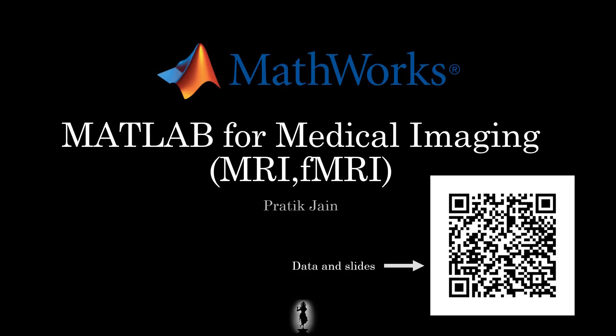Good, so yeah, this is MATLAB for medical imaging, in particular MRI and fMRI.